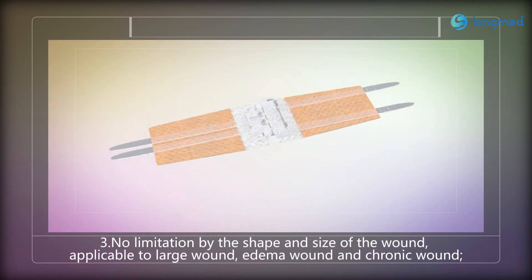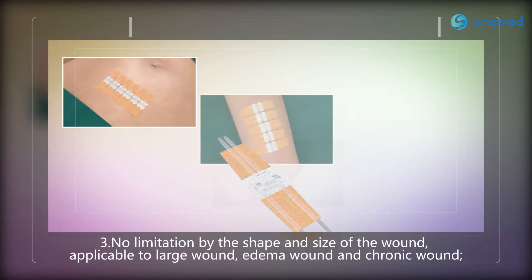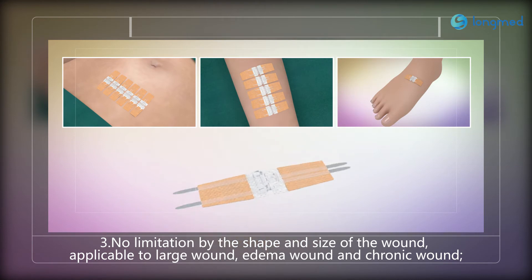Three: no limitation by the shape and size of the wound. Applicable to large wounds, edema wounds, and chronic wounds.